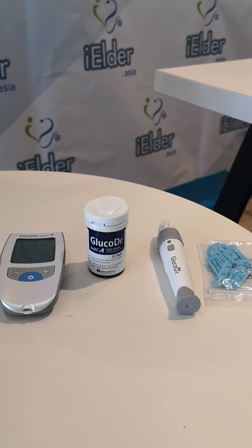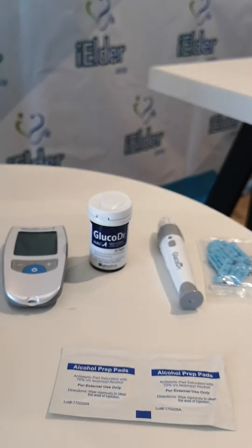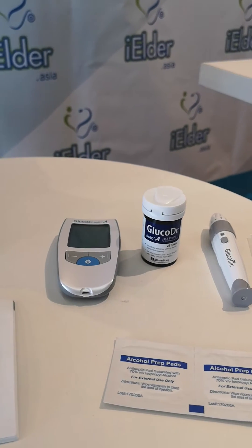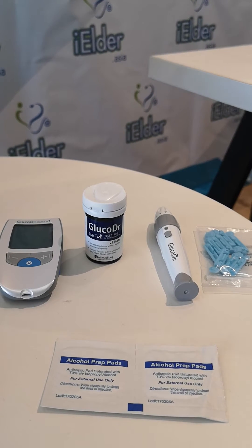What you may also need is some alcohol swabs to use when you conduct the blood glucose test. So basically, what's special about this blood glucose meter — a few things.